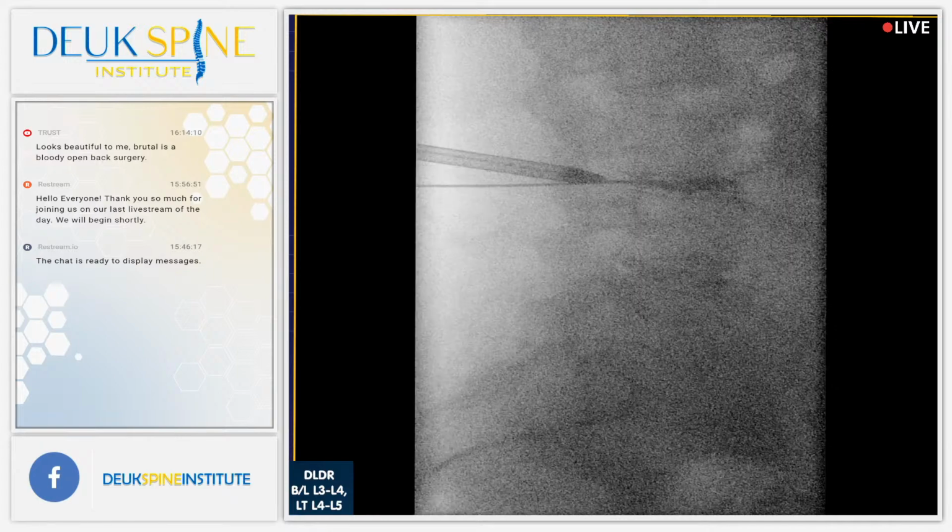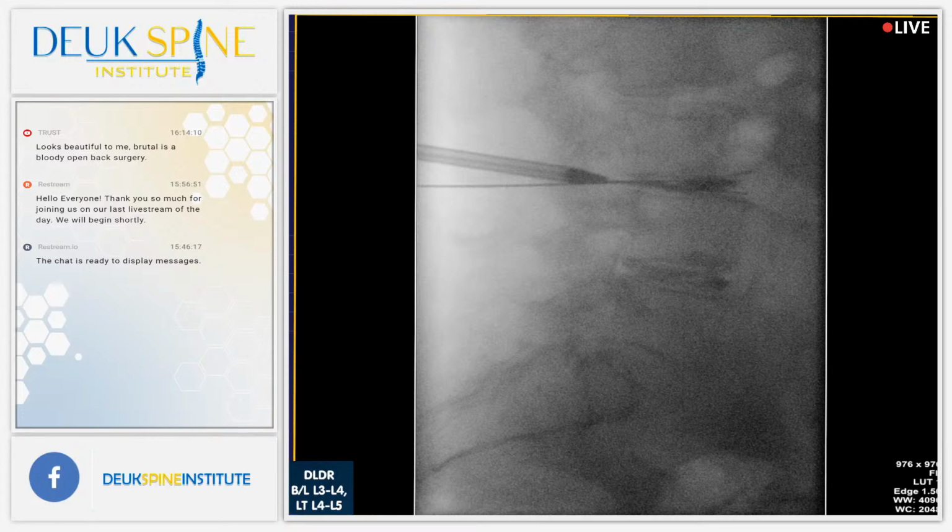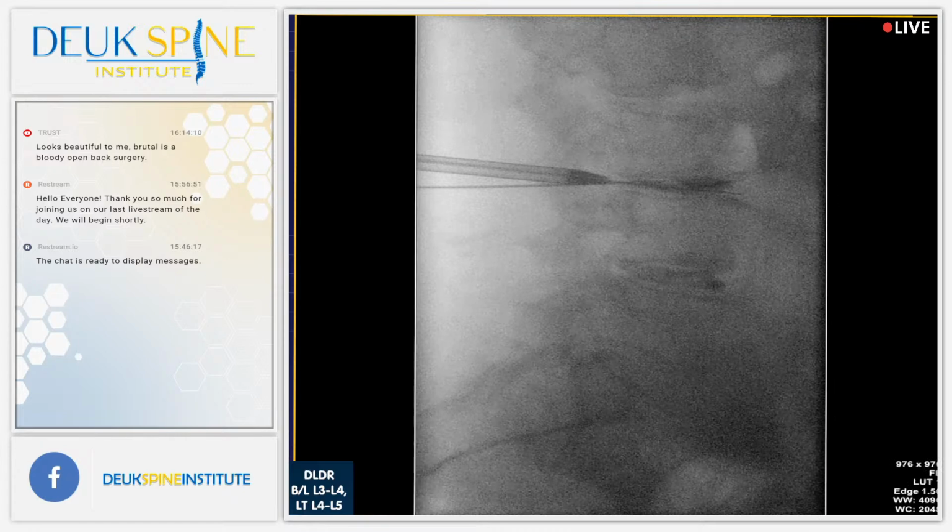All right. We're now doing number 3-4 on the left. Shot. Shot? Is that it?